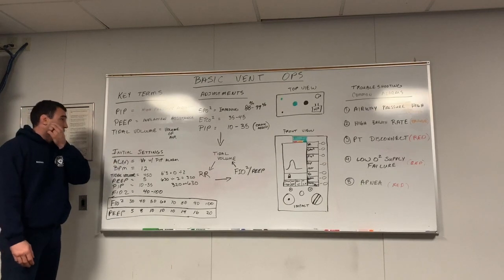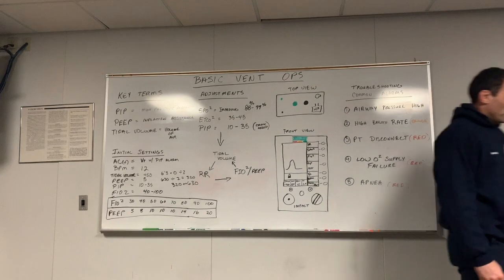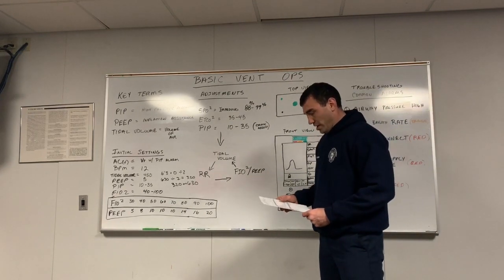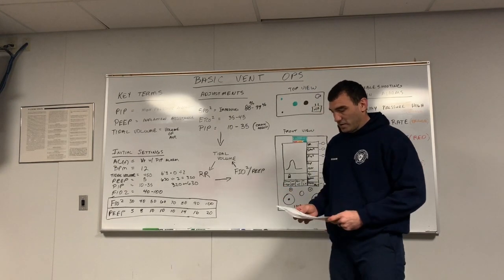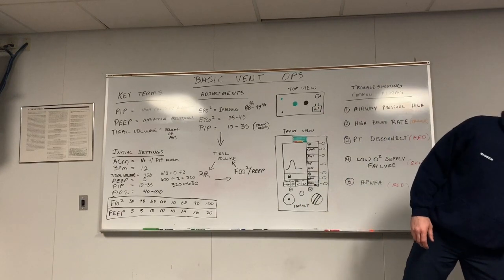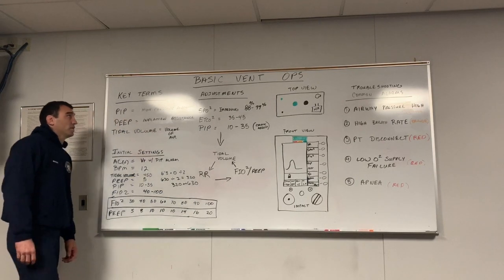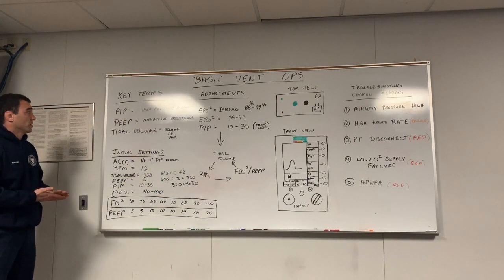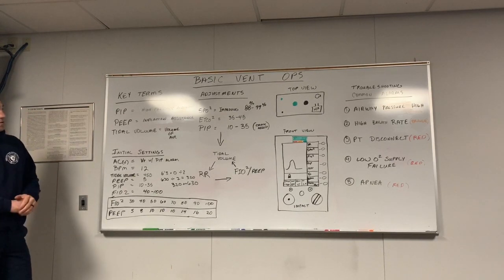This class can be watched and used for your March training to cover ventilation. So you have two 1085s coming up for March. One is ventilation and one is capnography. This can cover your ventilation CEUs for the month. Okay, so this particular class is over the basic vent operations. So we're going to cover AC mode in particular, how to set the vent up, how to put your initial settings on it, make your adjustments, and troubleshoot.